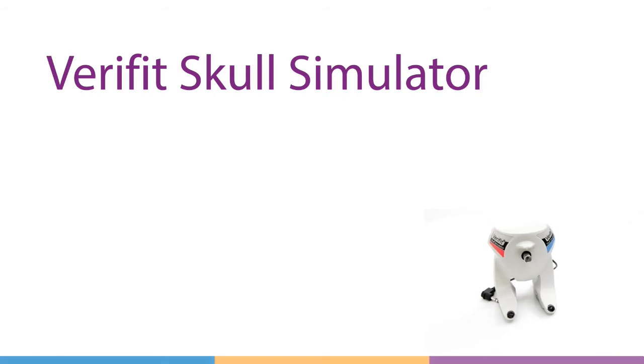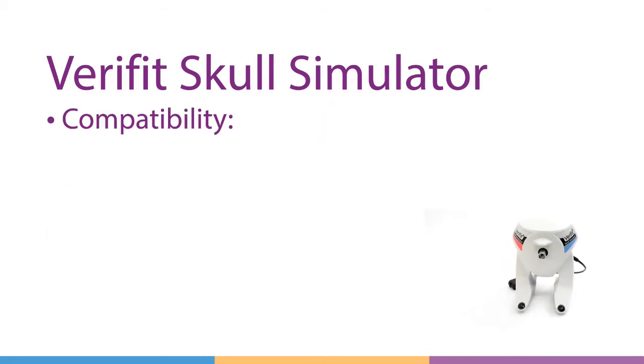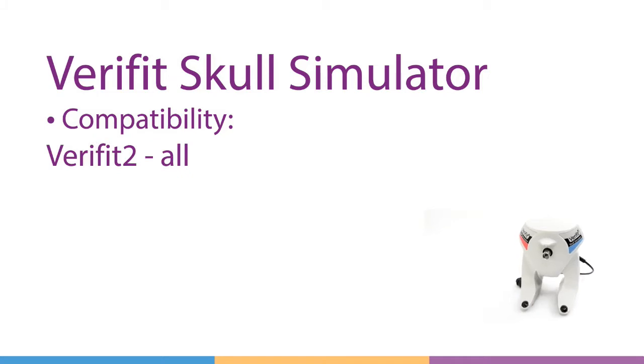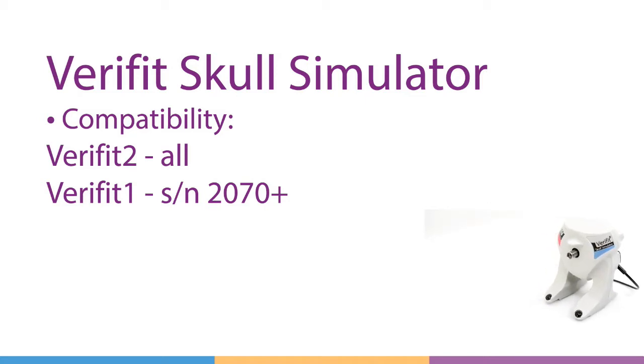The Verifit Skull Simulator allows test box verification of abutment-based bone anchored hearing devices on the Audioscan Verifit. It's compatible with all Verifit 2 models as well as Verifit 1 serial numbers 2070 and later. This video will give you a quick demonstration of how to connect and get the skull simulator ready for testing. We'll cover the Verifit 2 first and then the Verifit 1 in the second section.